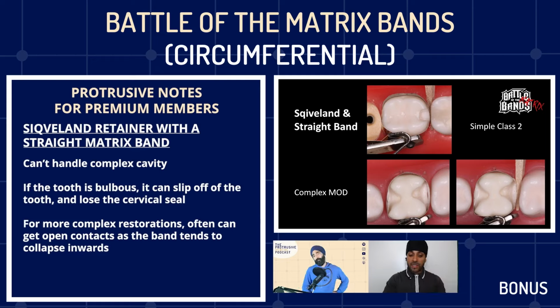Mm-hmm. I actually think using this is a bit of a risk, especially when we're using amalgam for overhangs, right? Because we need to pack amalgams quite tightly. And then, because we're trying to do the best for the patient, we're packing. Often it can squeeze out cervically and we can get that overhang and not really realize. And we're only really going to realize if we're really diligent with our probing post, or we take a post op bite wing, which isn't that common for amalgam, right? But I only say this because, like I say, I see a lot of overhangs, and that's what I typically fix, removing an overhang and restoring the tooth next door because of the damage it caused.